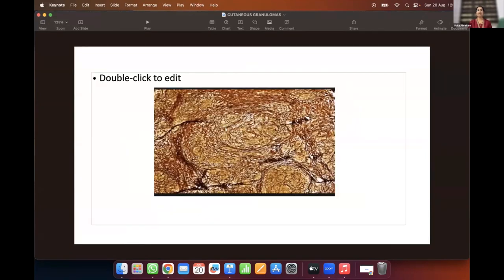Okay, so can anyone tell me what stain this is? What is the stain that is used here? Whenever we come across a case of sarcoidosis, we always do this stain. Has anyone given the answer? Yes, this is the reticulin stain which is done. You can see that the reticulin framework is rich within the granuloma and surrounding it. So this is a reticulin-rich framework. This is usually seen in sarcoidosis, whereas in tuberculosis, if you do this reticulin stain, you will see the breakdown of the reticulin fibers. So this stain usually helps us to tell whether this is sarcoidosis, in addition to the other special stains.